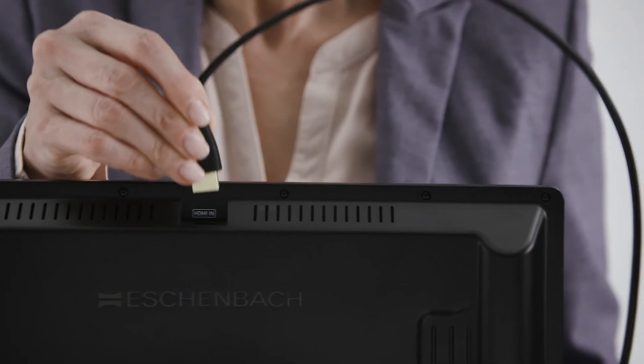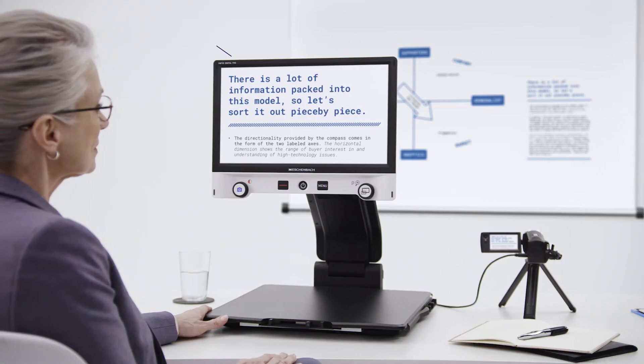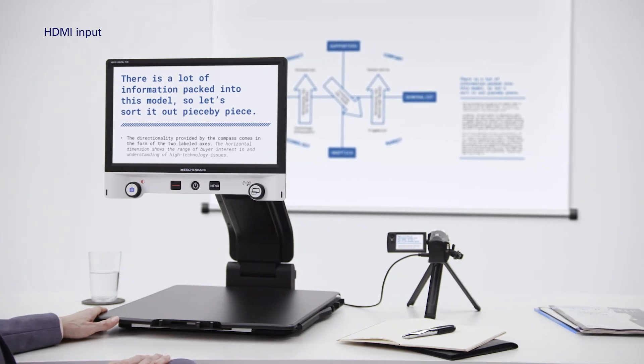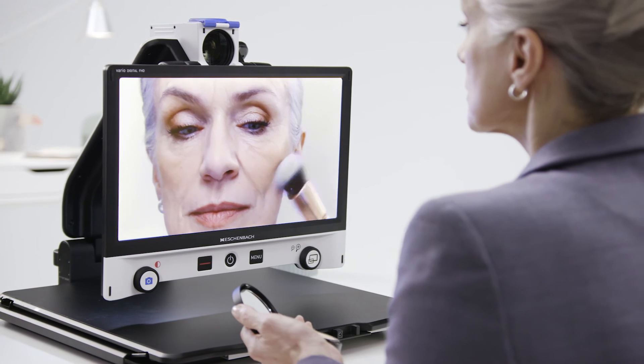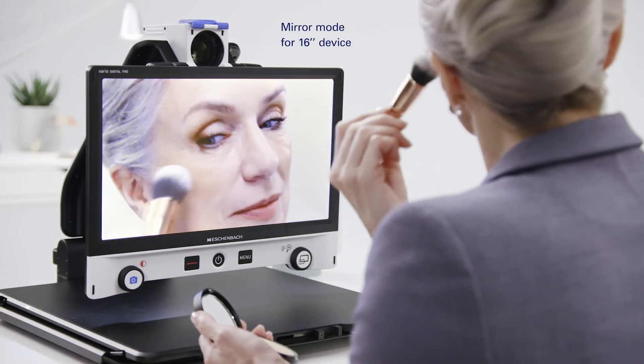You can connect the Vario Digital FHD Advanced to an external camera via the HDMI input, enabling you to view distant objects on the display. Thanks to its flexible design, the desktop video magnifier also has a mirror mode.